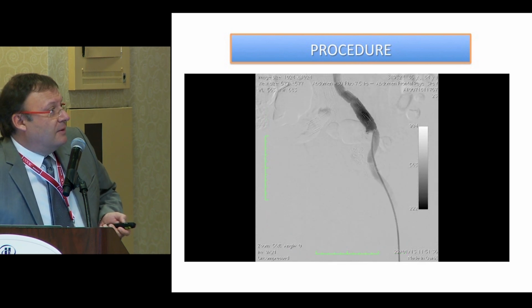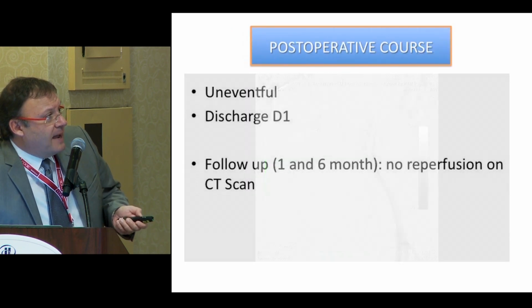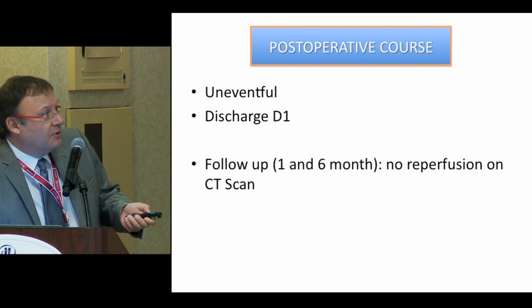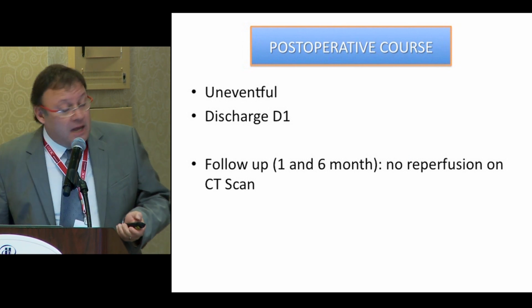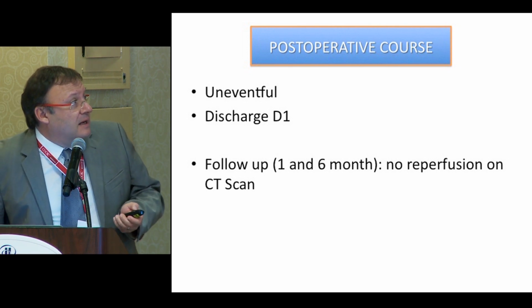We had no more distal perfusion. We had some clots, and we placed the sheath at the ostium of the iliac, and you see the stability of the device allowing to deploy the plug just at the origin and getting a perfect occlusion of the aneurysm. And the patient is well, and we had a control 6 months later.